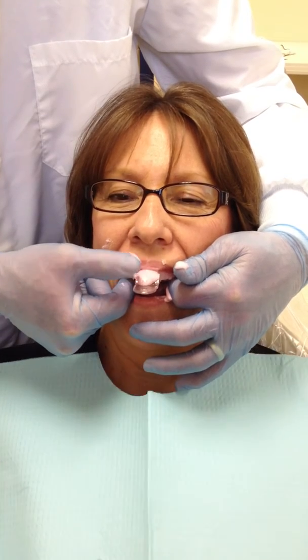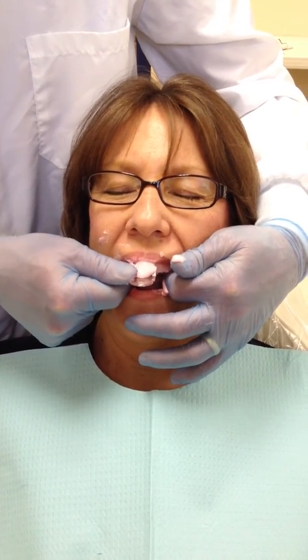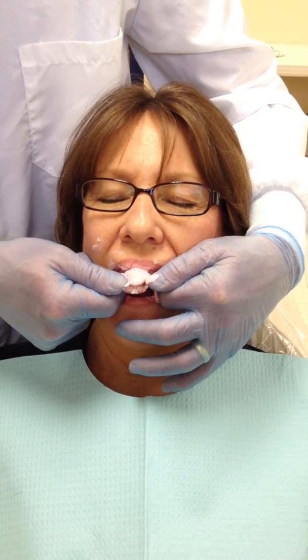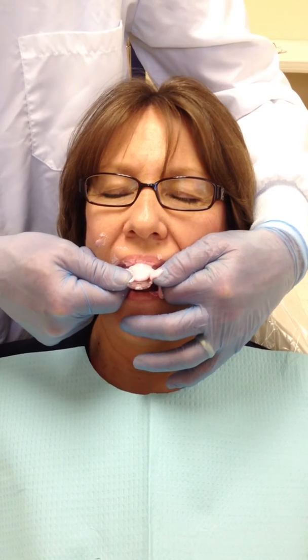We are starting to lose our gloss a little bit here. It is not set yet. You can see that it is still not set in the front, and it is still glossy on my thumb from when I mixed it. We know it is not set when it has that gloss — when it loses that gloss, we will know that it is set.